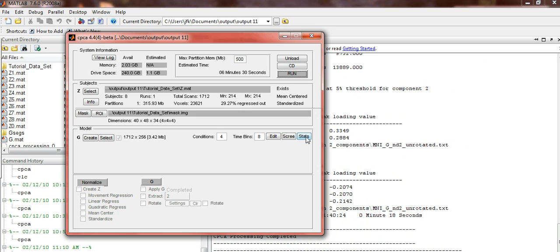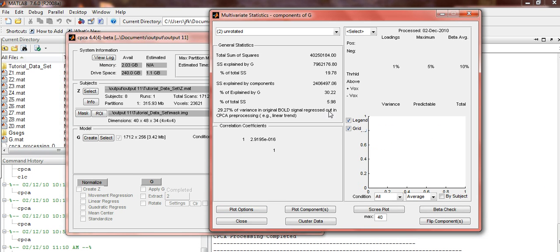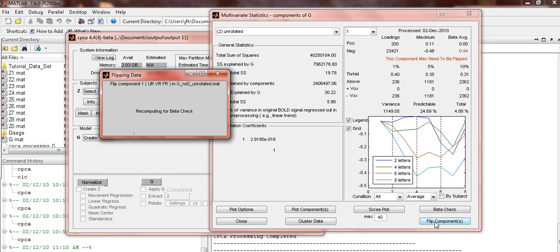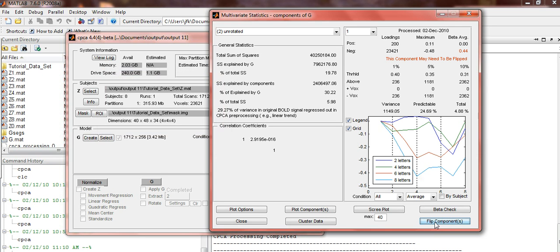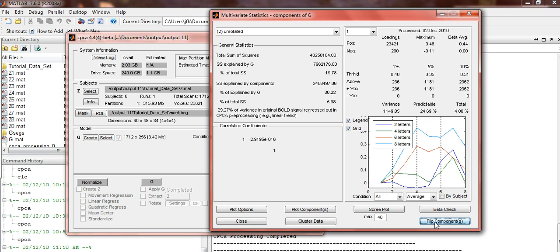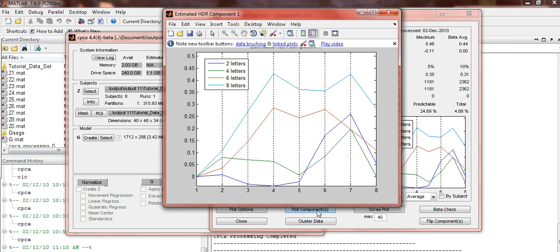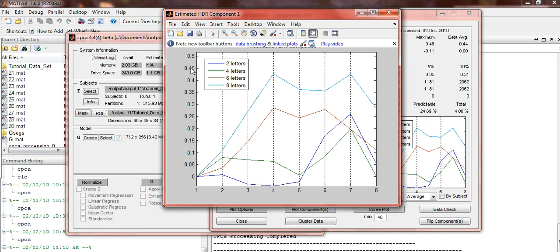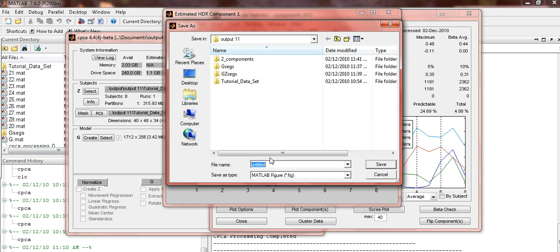Press the Stats button. Select Component 1 in the drop-down menu. You should see a graph that looks like this. This component may need to be flipped. To do so, press the Flip Components button. Once this is done, press Plot Components. File, Save As, and save your graph.